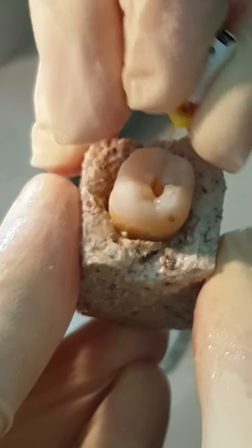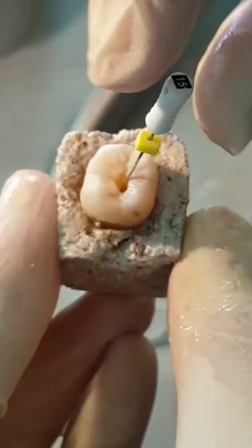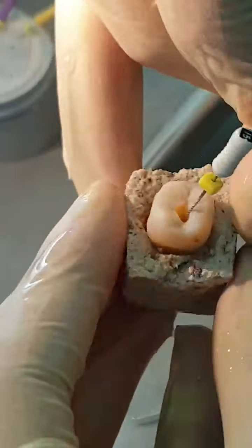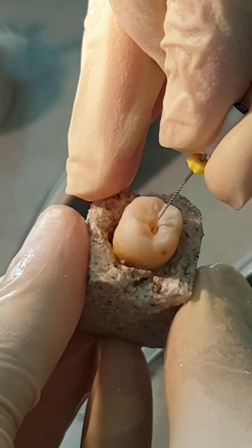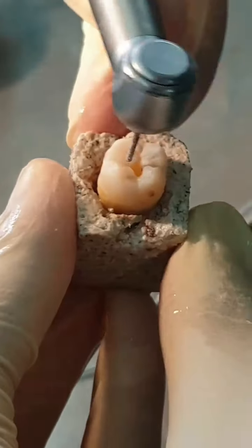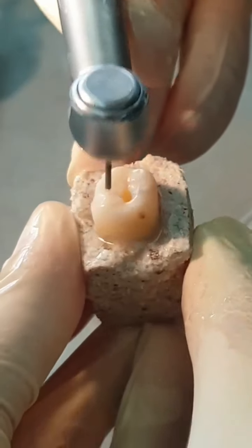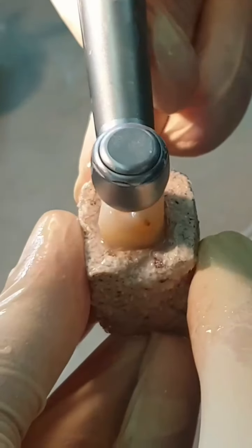Actually, we find the mesiobuccal orifice, but we don't have a straight line access in this area because the file enters the canal with a sharp angle. So we need a little bit of extension in mesiobuccal area to have a better access to that canal. Again, we use the walls of the burr, not the tip in this stage, because we are already in the floor of the pulp chamber.